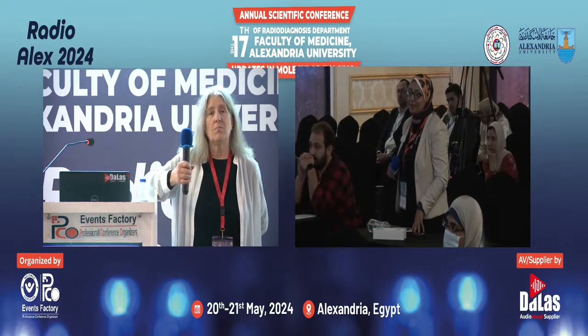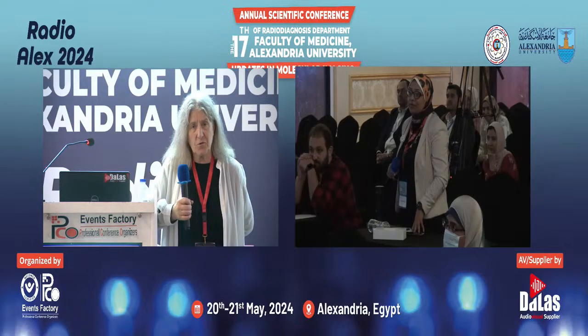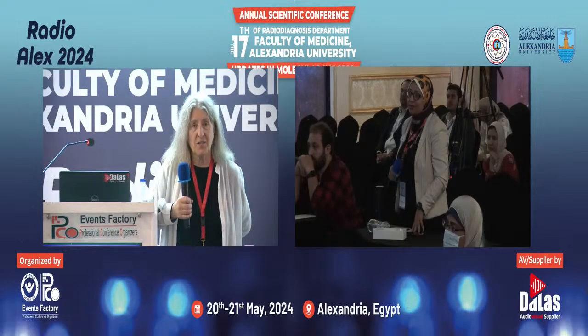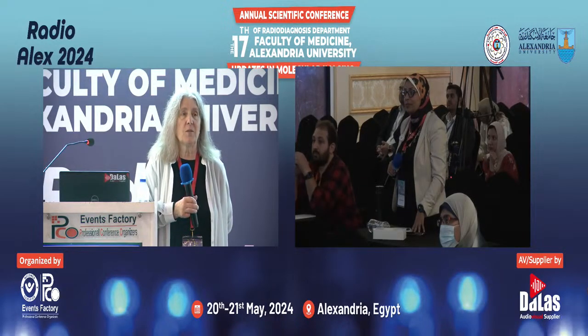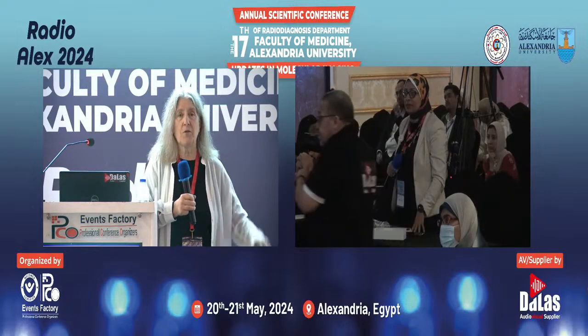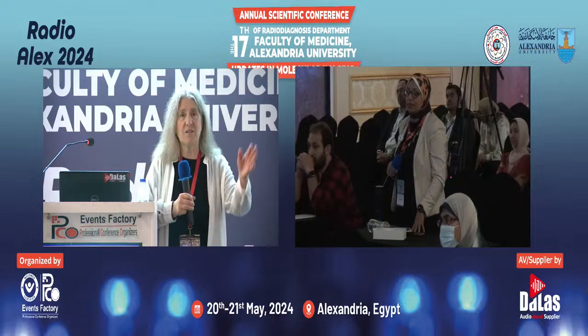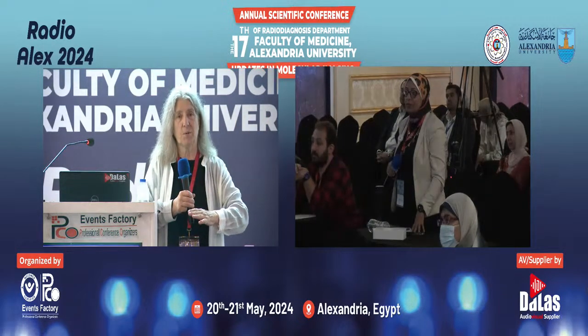I don't know. So after treatment of peritoneal carcinomatosis, what do you expect to see in terms of the SUV max? Is that the question? With successful treatment, it really helps in peritoneal carcinomatosis to have a preoperative or pre-treatment PET scan. And I'm not aware of any data that supports how much of a decrease you're supposed to see or not.